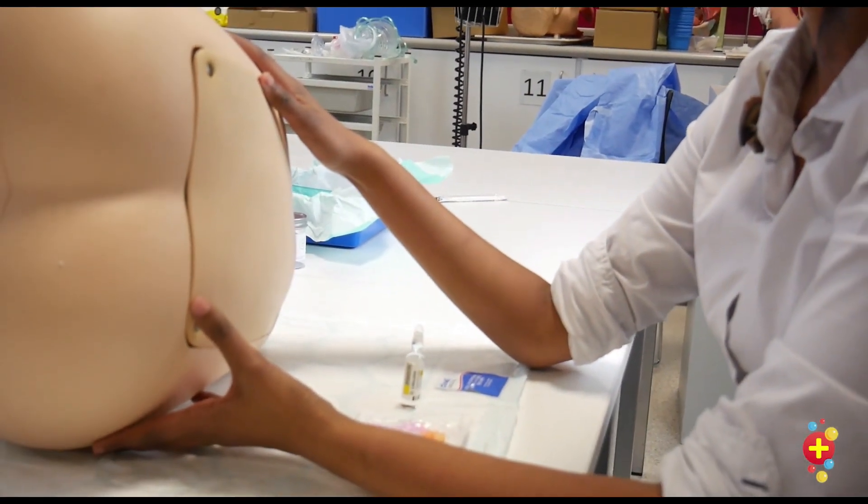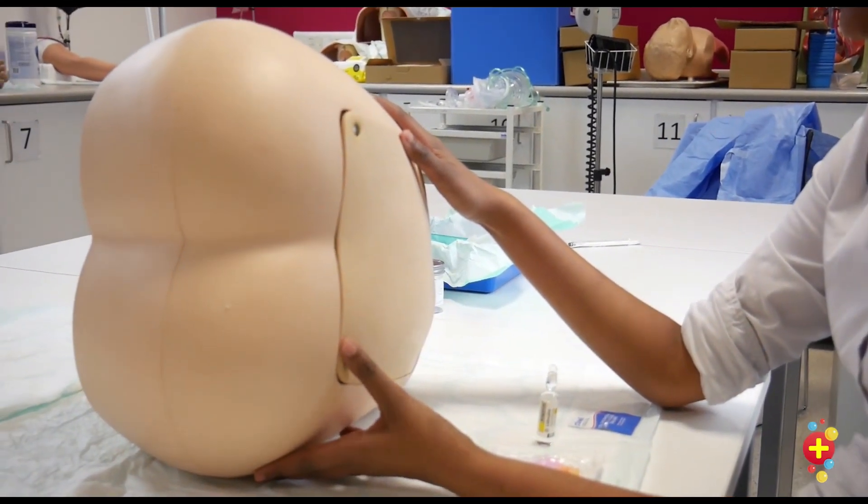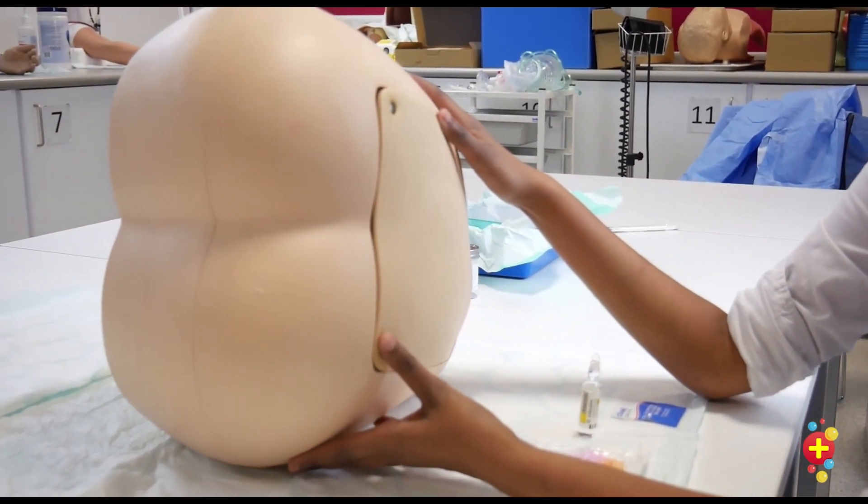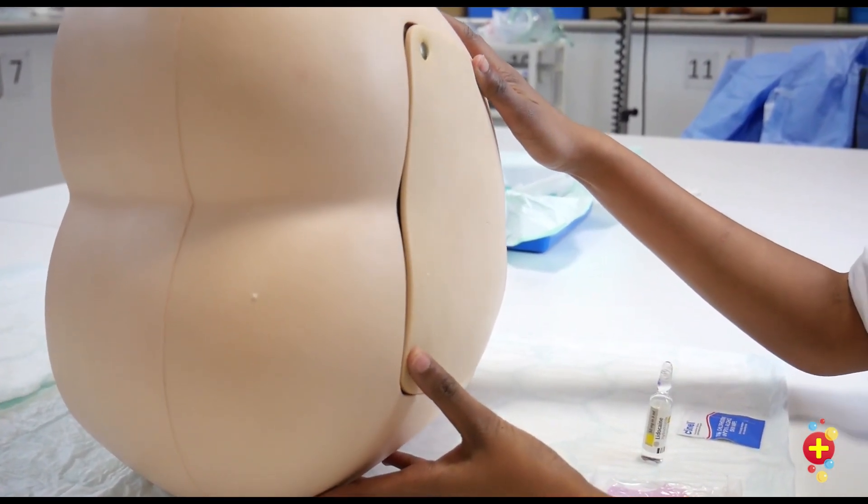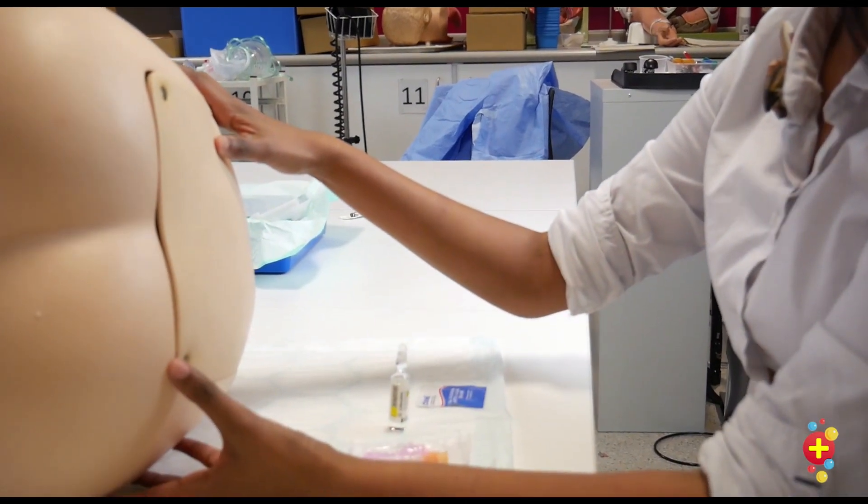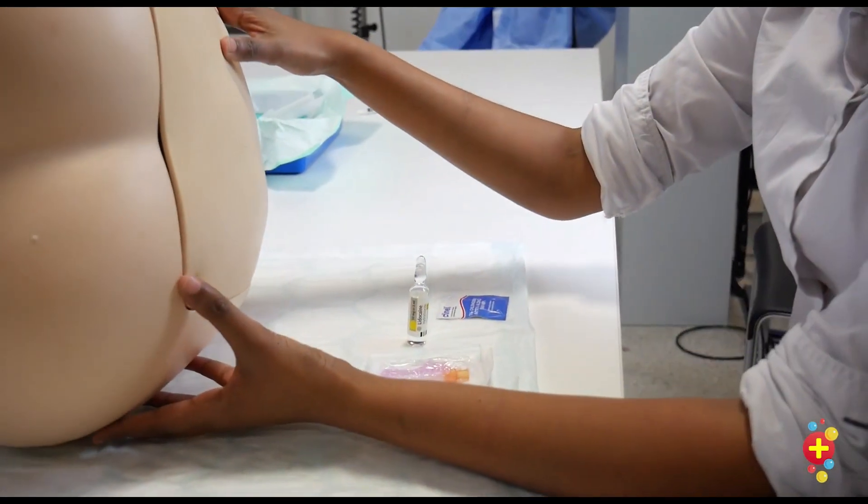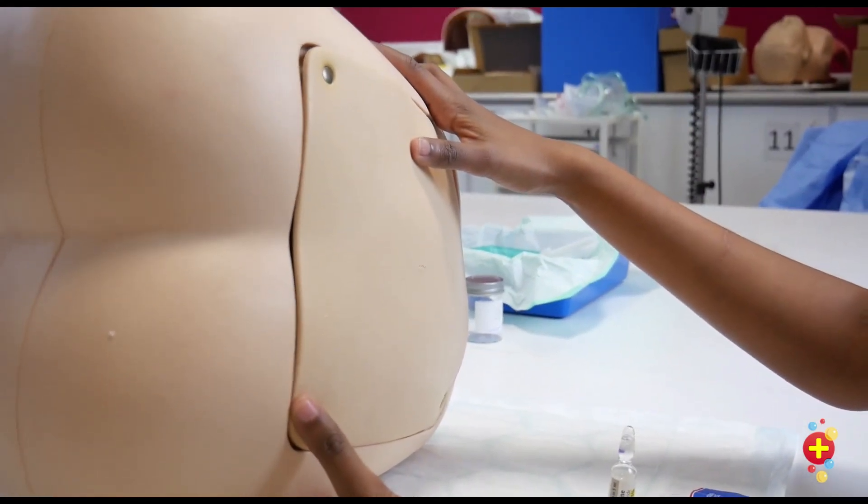The most important thing when preparing for a lumbar puncture is making sure that your patient is in the correct position and that you're comfortable with the positioning. You want the bed at the height that is comfortable for you, and you can decide whether you're going to sit or stand for the procedure. The patient should be in the left or right lateral position with their knees to their chest.